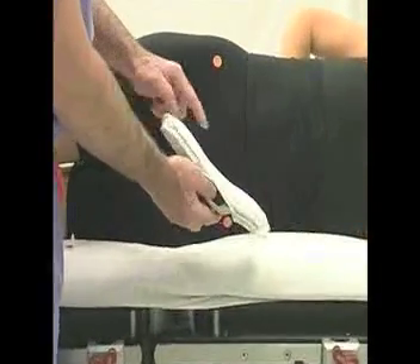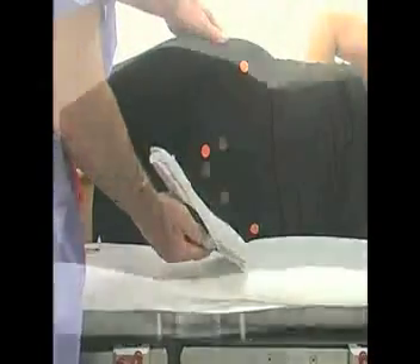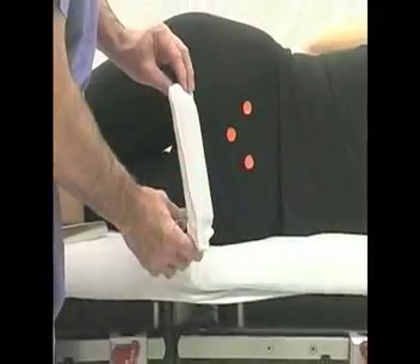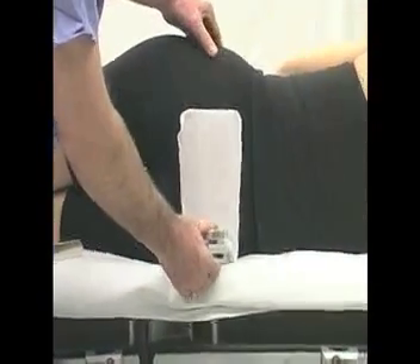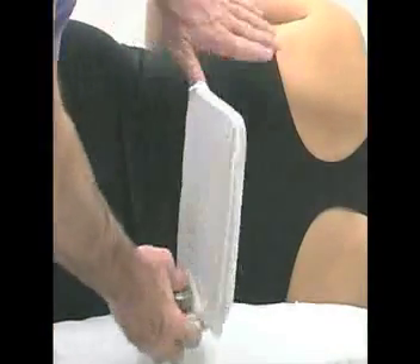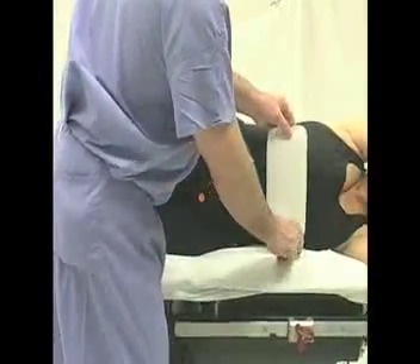The bony anatomy of the pelvis is demonstrated by the dots: upside anterior superior iliac spine, downside anterior superior iliac spine, symphysis pubis, downside anterior superior iliac spine, posterior pelvis, and posterior superior iliac spines, as well as the flat part of the sacrum.